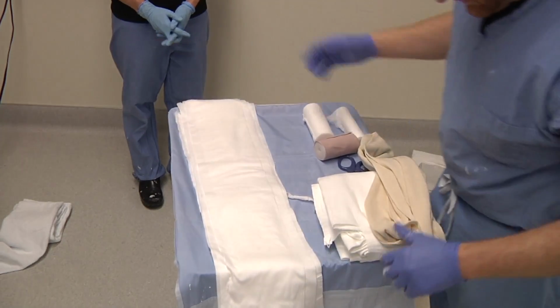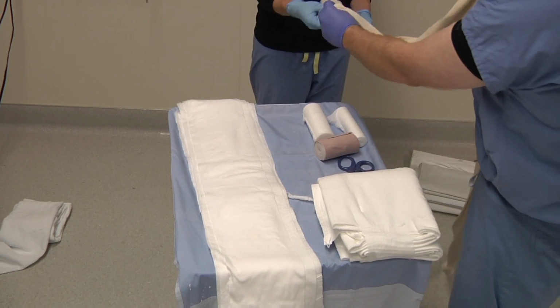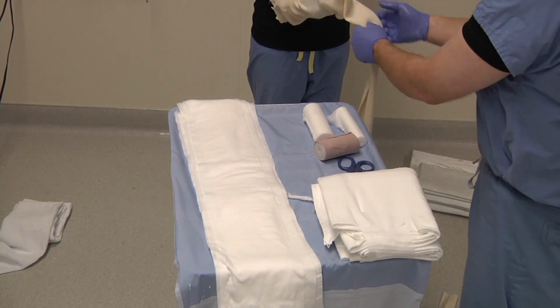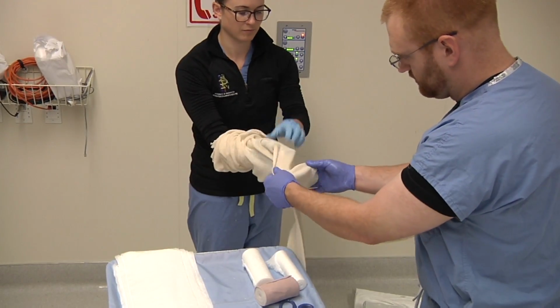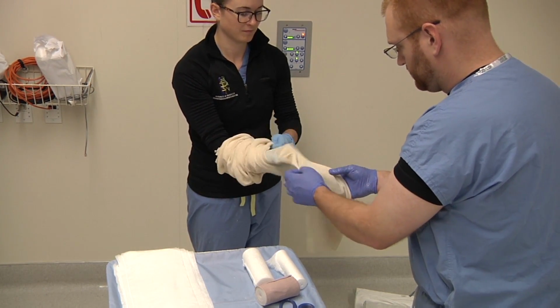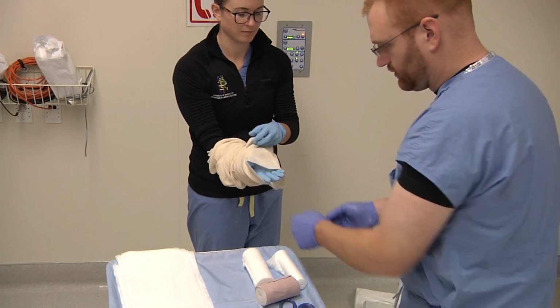Next, you'll need an assistant. Dr. Thayer here is going to help me. She will take one end and roll up, stick her hand in, to the other end. Perfect.